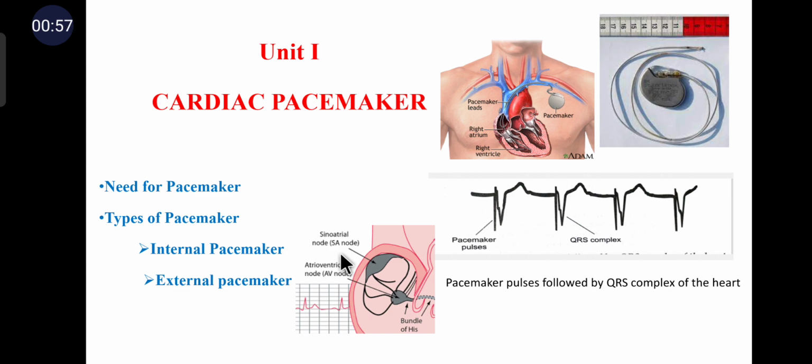In an abnormal situation, if this pacemaker ceases to function or becomes unreliable, or if the triggering pulse does not reach the heart muscle because of blocking by damaged tissues, the natural and normal synchronization of the heart action gets disturbed. When monitored, this manifests itself through a decrease in the heart rate and changes in the ECG waveform.